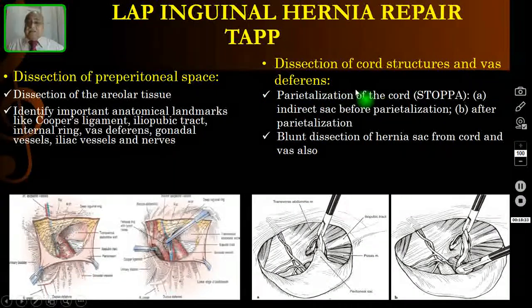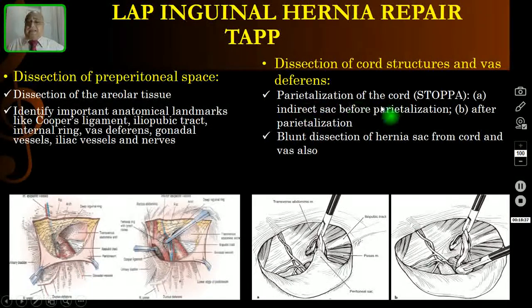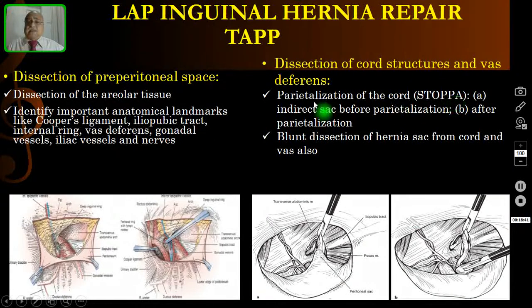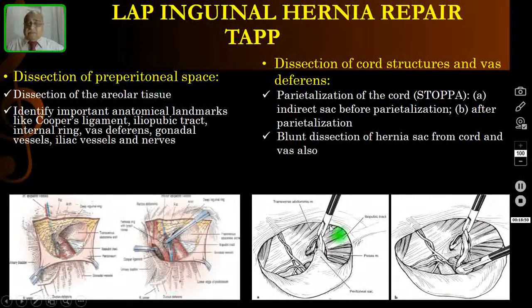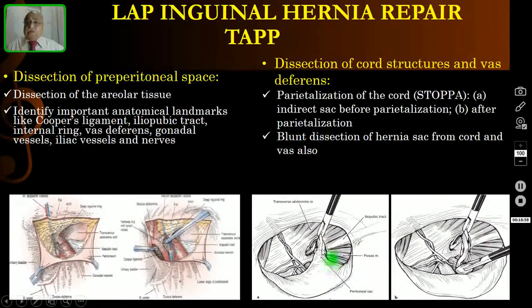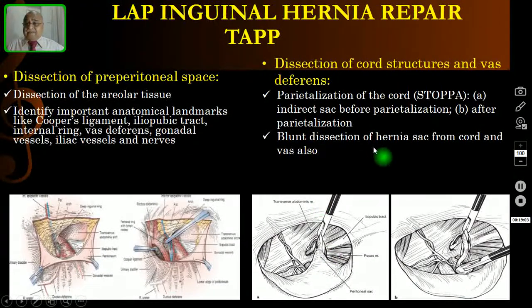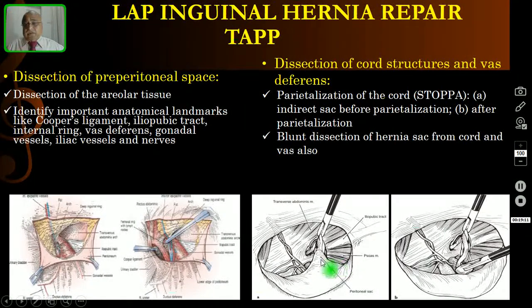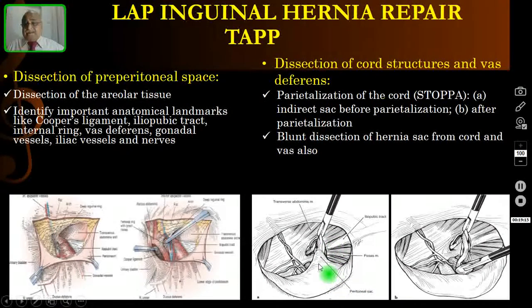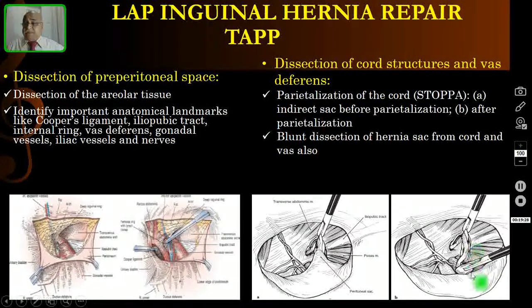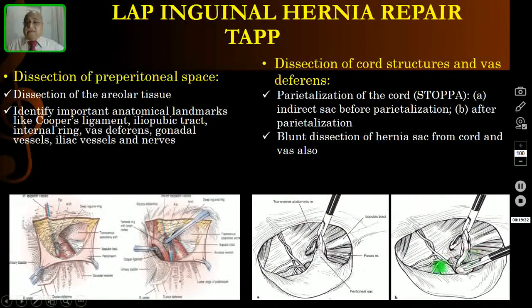Dissection of the cord structures and vas deferens involves what Stoppa described as parietalization of the cord — that is, skeletonization of the cord structure. The hernial sac or peritoneum is attached to the cord and must be freed by blunt dissection, removing any attachment to the vas deferens. In the second picture, a gauze piece is used for blunt dissection, and the peritoneum is completely removed from its attachment to the cord. This is parietalization or skeletonization of the cord.